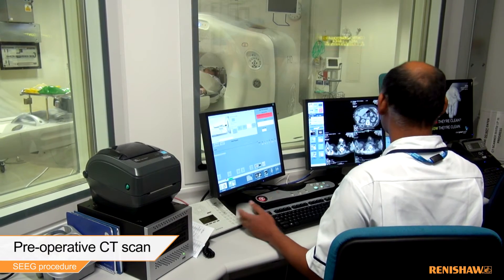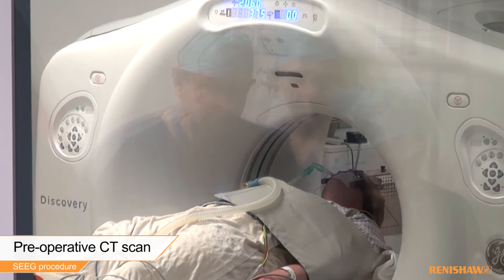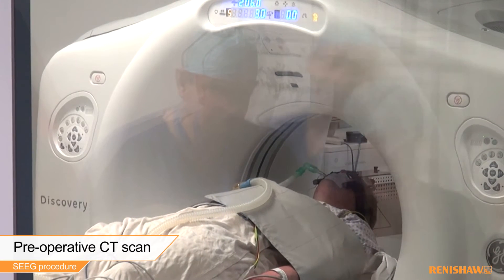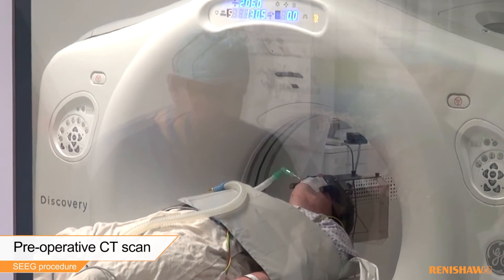During SEEG procedures, as many as 20 electrodes may be used to identify the origin of seizure events within a patient's brain, so both accurate planning and delivery of each trajectory is vital.